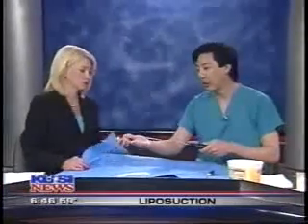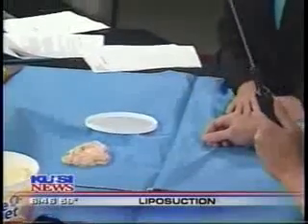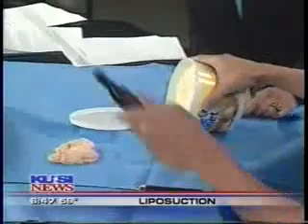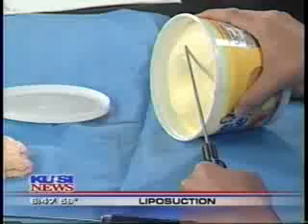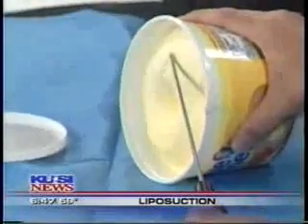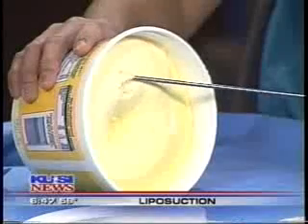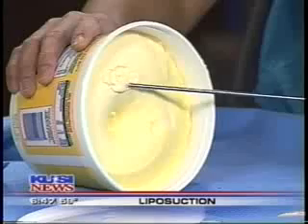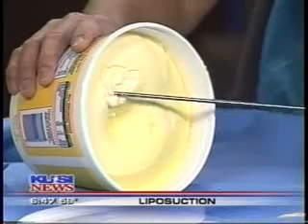Well, this is an interesting thing. You can just show that when the probe is on, it doesn't hurt your skin. And you can't hear anything because it's so high frequency that only dogs can hear it. But if you take a tub of butter, which I would think most of us would agree is fat, and you hold it right there, if you get a close-up of that fat, it just melts away. And this is hard butter just out of the refrigerator, so you can get an idea of how gently that technique can melt the fat.